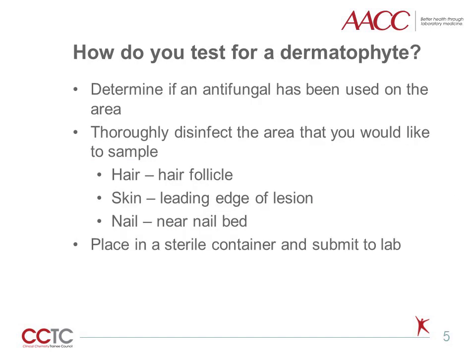The first step for testing for dermatophytes is to first investigate whether an antifungal agent has already been used to treat the patient. Since an important step in testing for a dermatophyte is culturing the organism, it is useful to know if treatment may preclude growth of the organism. If a topical antifungal has been utilized, it is suggested to wait 14 days until trying to culture.